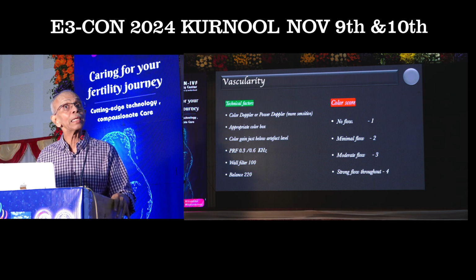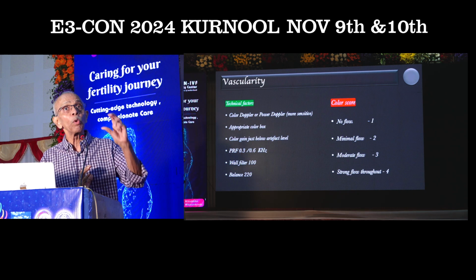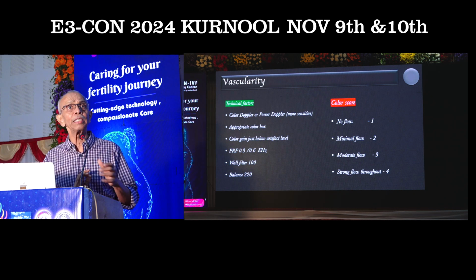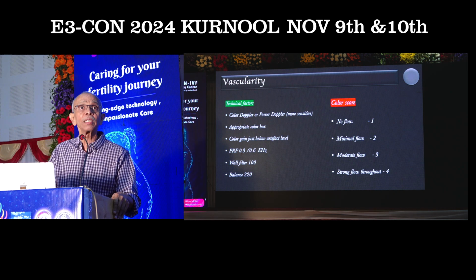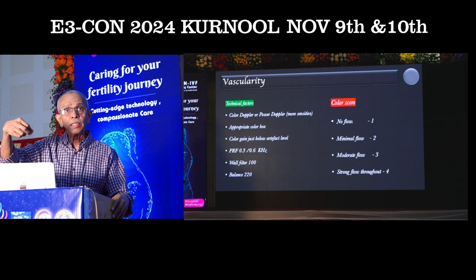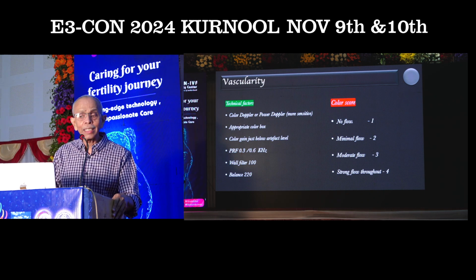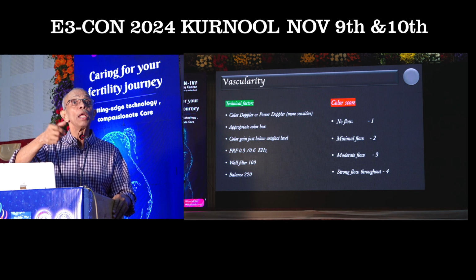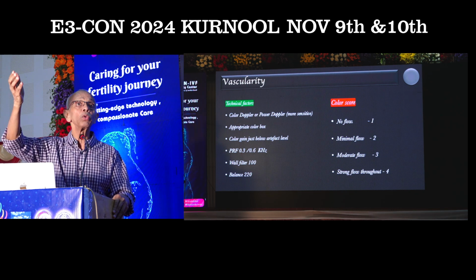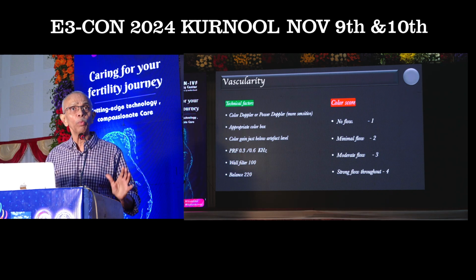Then you have the color gain. With color gain also, you should not have a splash of colors, or bleeding in the vessels, but you should have an appropriate color gain in order to appreciate the vascularity. We have to always adjust the PRF, the pulse repetition frequency, which can be easily toggled from 0.6 to 0.3. Quite often I use about 0.6 kilohertz, and that is when you can appreciate slow flows also. If you use a PRF of 1.2 or 1.3, then your color flow will not be seen. That is the reason why you need to have an appropriate PRF.